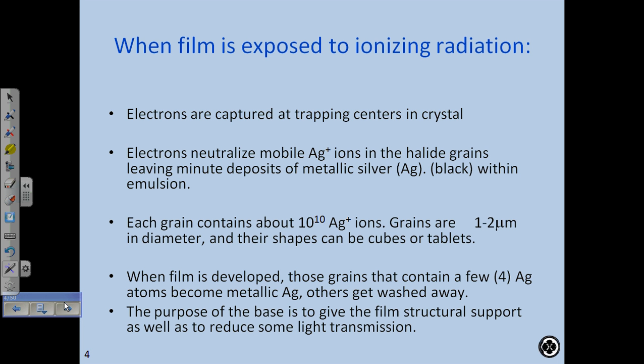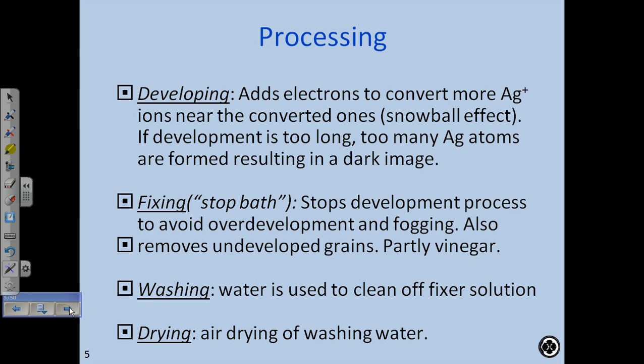But why is it blue and not clear? It's blue because when you hang it on a light box, if it was completely clear, there'd be too much contrast. And that's harder to read for radiologists. That's harder to read than a film that has less contrast. So over the years, that was just a preference of radiologists, that they'd like to reduce the areas where there's no radiation. They'd like to keep that a little bit blue, a little darker than just clear.